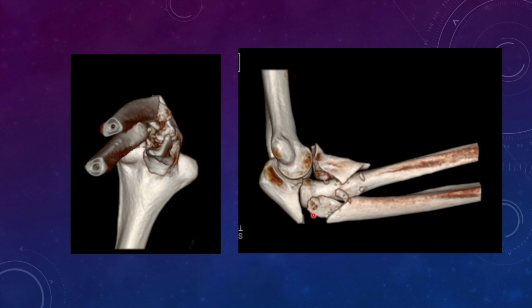So we need to see intraoperatively whether it is having any insertion of the ligaments, and we have to secure this fragment either by plate, and if the plate is not possible, we can take some bites at the insertion of the lateral collateral ligament, and those sutures need to be fixed either to the ulna or the plate that we are going to use for fixation of the olecranon, as we will see in the coming images.